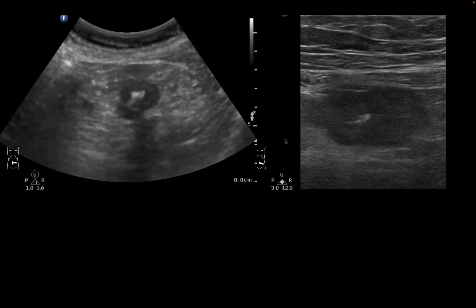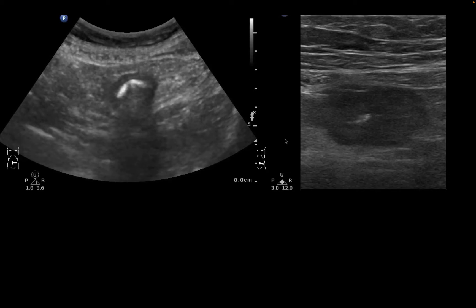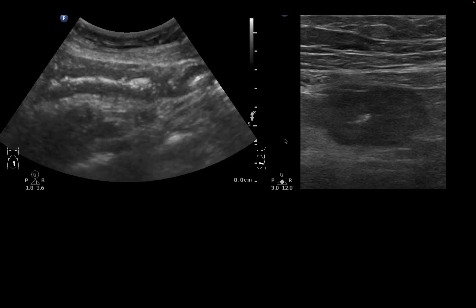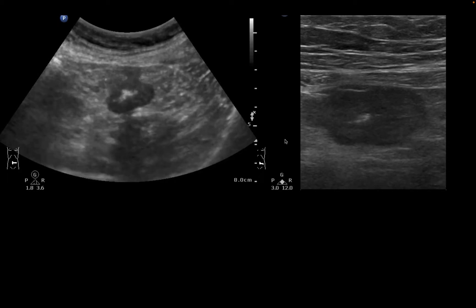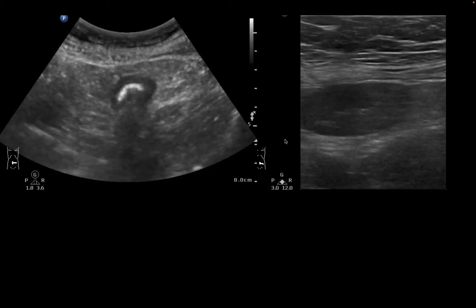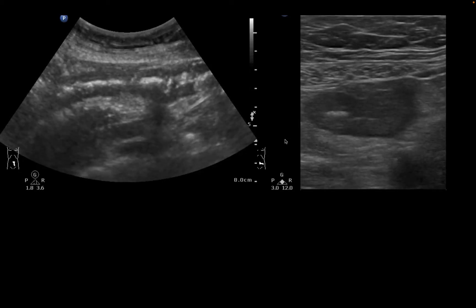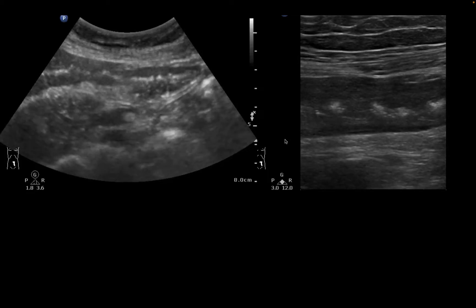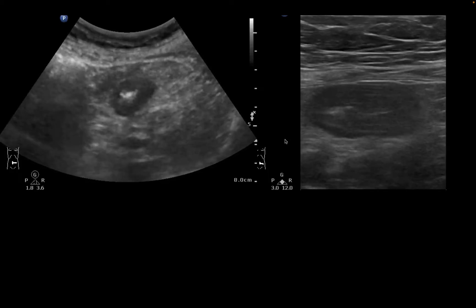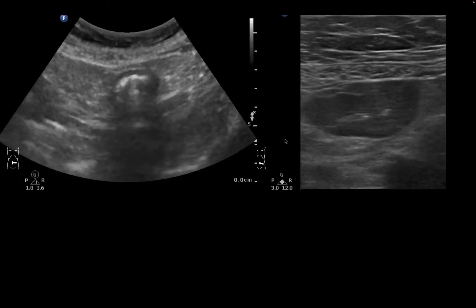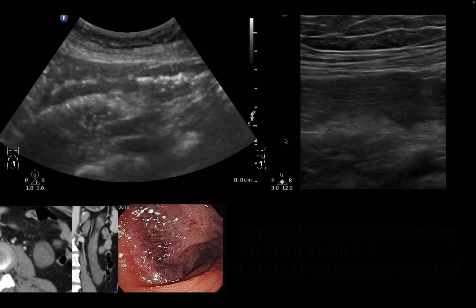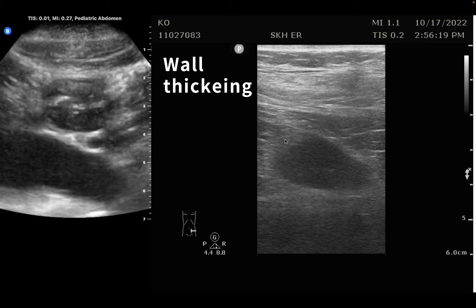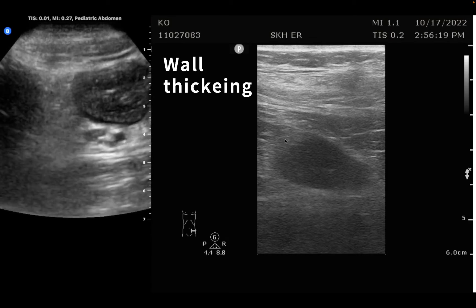Let's take another example. The wall is thickened, the stratification disappears. It's a long segment over the sigmoid and descending colon. Using a linear transducer, we don't see the typical stratifications over this long segment. So when you have patients presenting with this pattern of sonographic anatomy, you should consider ischemic colitis.